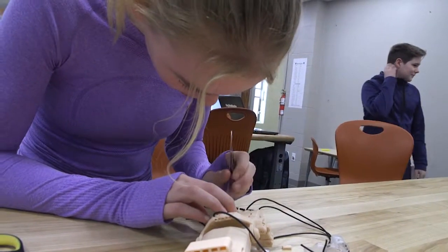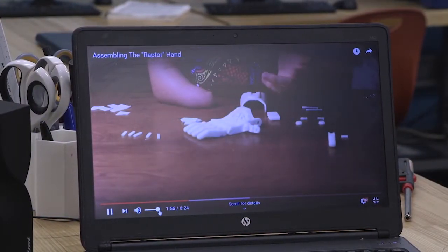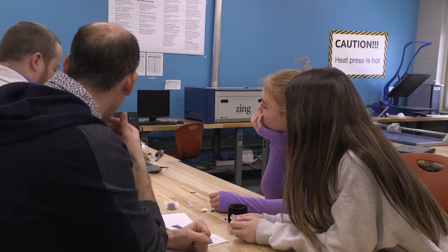As students struggle with the flexible cord, they are humbled to watch a video of a person with one hand doing the job. It's kind of mind blowing because it's already hard enough for us to understand and build something like this, and I can't imagine someone with one hand building their other hand.